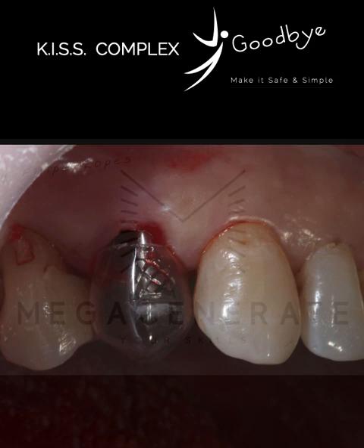You can do a provisional with a CAD CAM or even a direct provisional. I'll go into a lot of detail on this case later on, as I've told you. I'll go step by step on this.